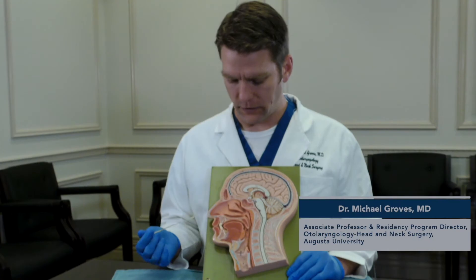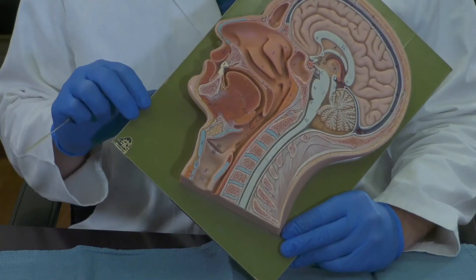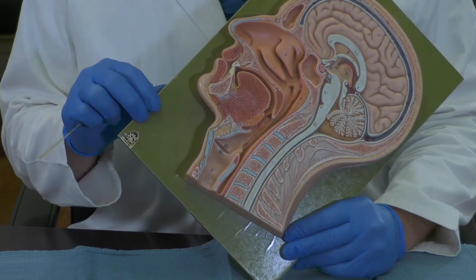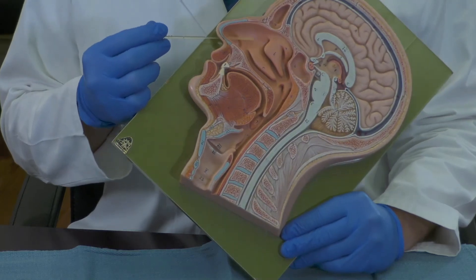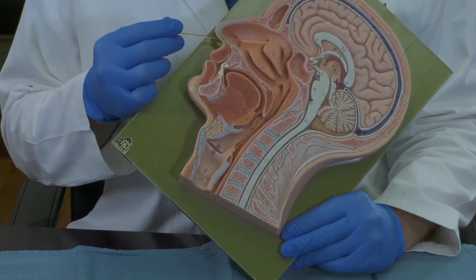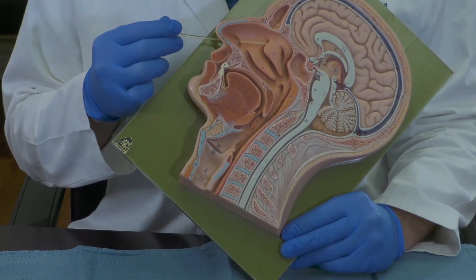When you're obtaining the nasopharyngeal swab, a common mistake is to want to tilt the head backwards. Some guidelines suggest as far as 70 degrees, which would be all the way to here. That's for the purpose of making it easier to insert the swab into the nasal cavity, but unfortunately at this angle, if you were to advance horizontally — which is a natural motion for the tester — you're likely to strike the middle turbinate, which is a sensitive structure hanging off the side of the nose.